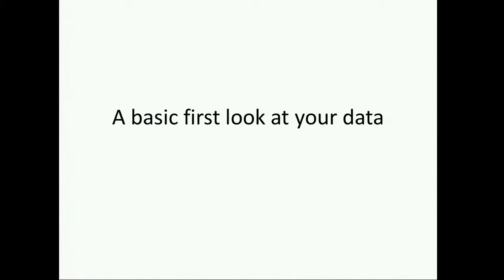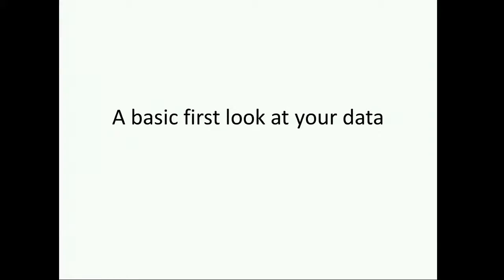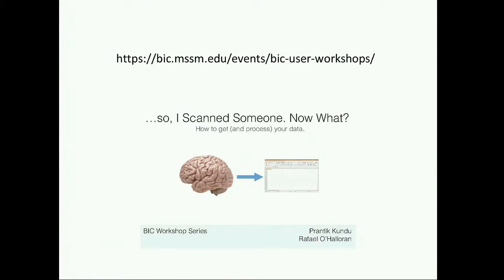But I think actually I can totally admit that I've been here and acquired a bunch of data and then found that my field maps were all wrong, for example. So I'll be the first to admit that this has affected me. So I just want to talk very briefly about a couple of BIC tools and your own take on how maybe you might want to take a look at your data and a few common artifacts. And I'm going to really whip through this because most of it's not new, and I'm sure if you've done an MRI course, you've heard it before.